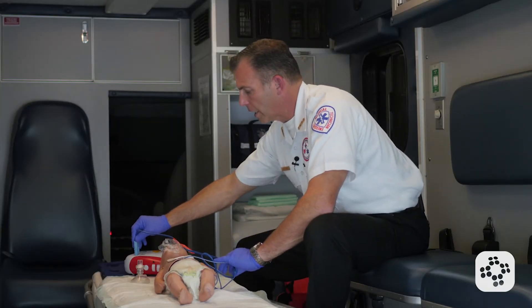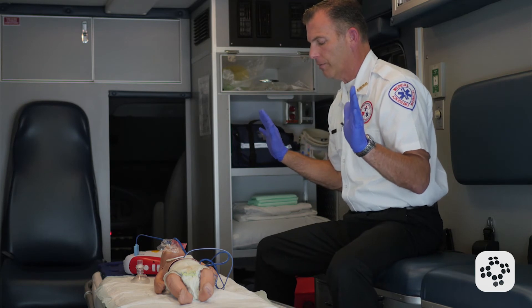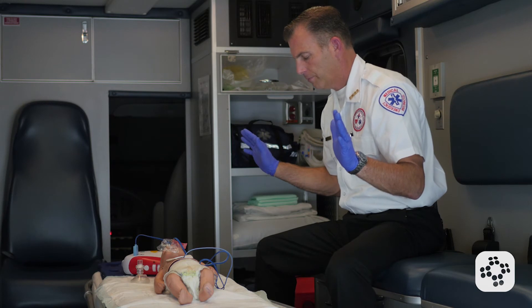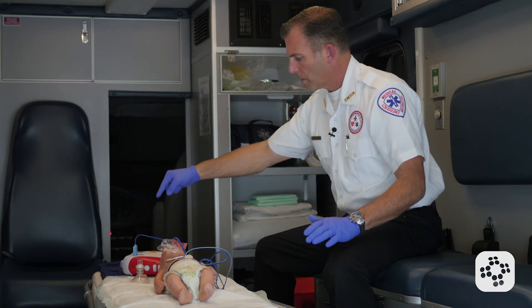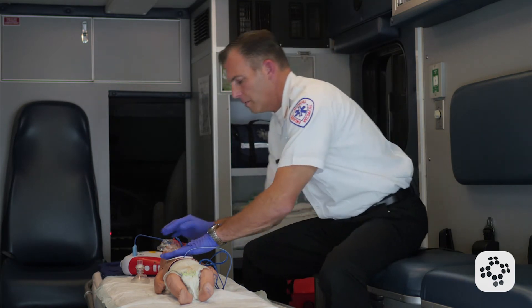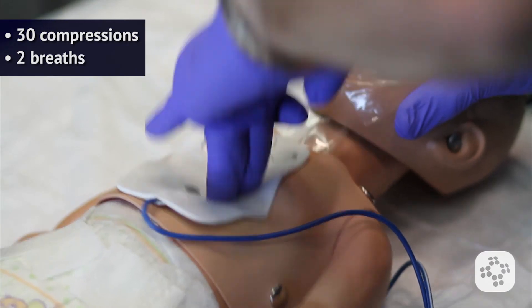Now I plug in the connector, stand clear, and do not touch the patient. I'm prompted to push the flashing yellow button. Then I go into 30 compressions followed by two rescue breaths, performing compressions right over the AED pads — I will not remove the AED pads.